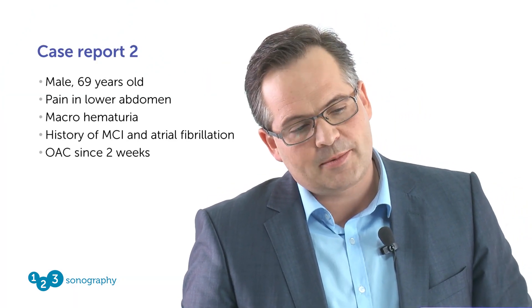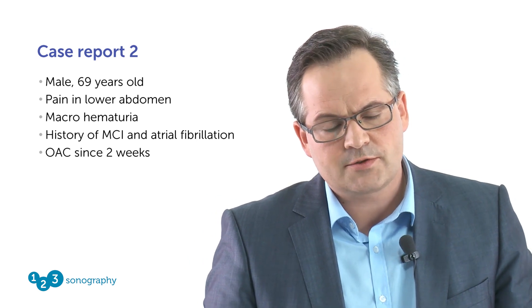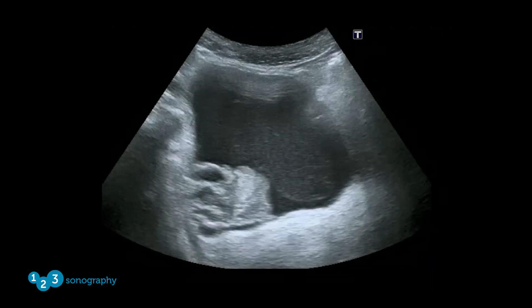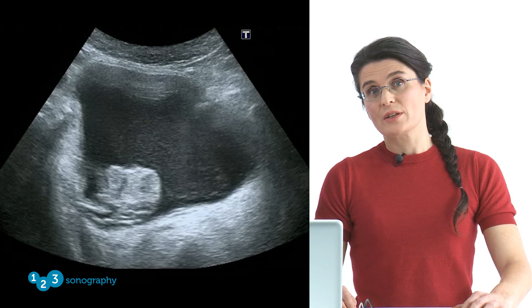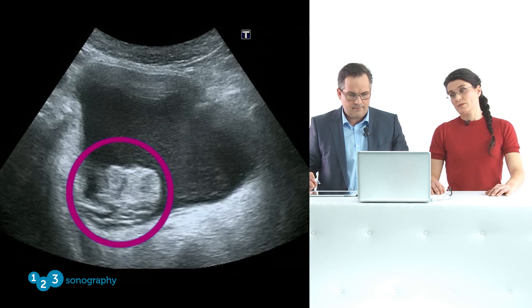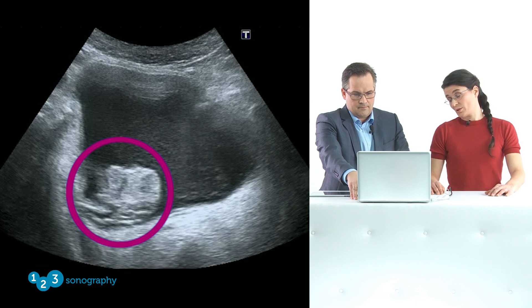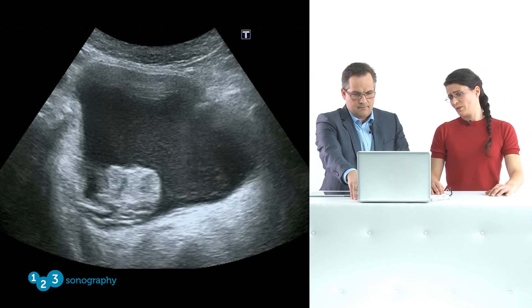We have another case of a patient with pain in the lower abdomen. I was on night shift again. A male patient came to our hospital and complained about pain in the lower abdomen. He had a medical history of a myocardial infarction one year ago, and two weeks ago he was diagnosed with atrial fibrillation and received oral anticoagulation. We did a scan. We can again see a urinary bladder — this fluid-containing, quite dark object. But we can see an object that should not be here. It's white, meaning it's hyperechoic. It's round and it's on the left side of the picture, somehow connected with the bladder wall.